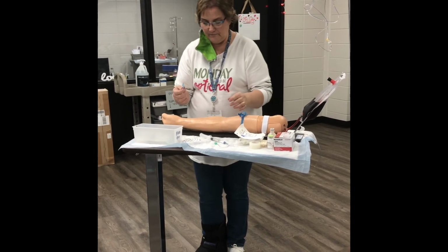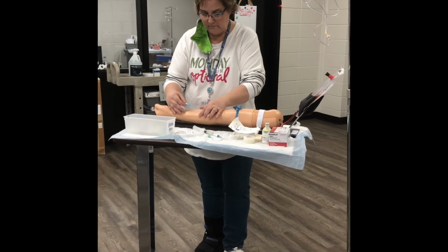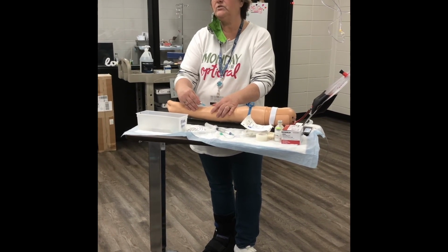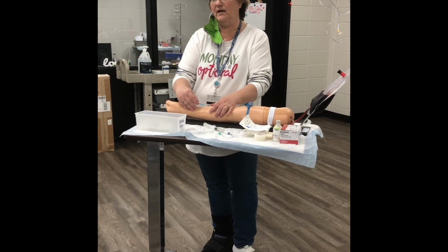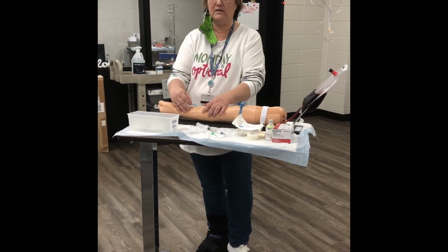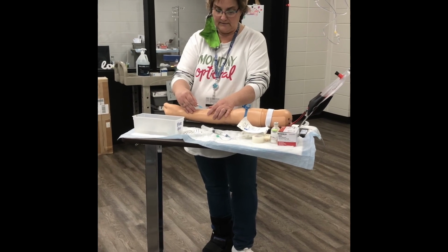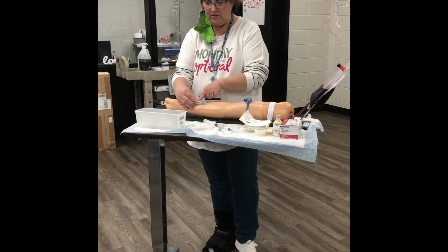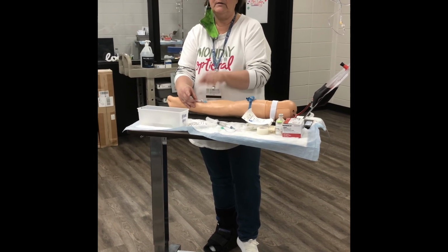All right, so I'm going to retract the skin. I'm going to go at about a 25 degree angle. If you shake and accidentally touch the skin, you need to re-clean and get a new needle. Even though it was all sterile, you can't pick it up and then touch again, okay? All right, I felt it pop. I'll lower it. Now, you should get blood return back right here.